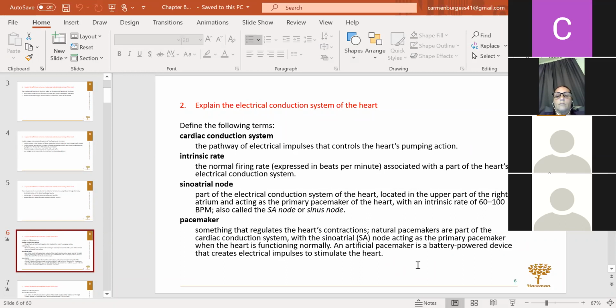Now, can I say, oh, well, my athlete is at 52, is he still firing? Yes, because that is a whole different thing. But we're talking about a person with a heart problem that you can clearly see on your EKG, and it's 40, then you know that it is not firing correctly.